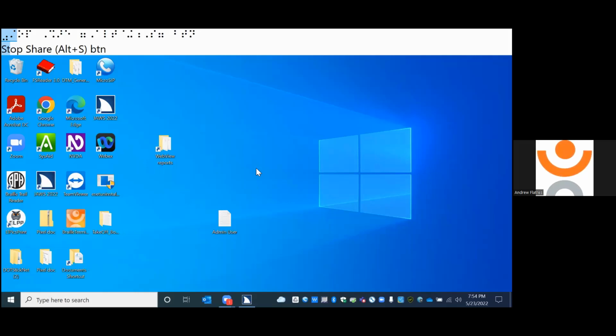Keyboard echo, words. Like all text-to-speech devices, you have the option of keyboard echo. So how do you like your keyboard to be echoed? So every time that you type a character, or every time you type a word, or maybe it's both characters and words. So each time you type a character, it will give you audio feedback. And then every time you press a space, it will read aloud that word. So again, you have full control on how you want your keyboard echo to be controlled.